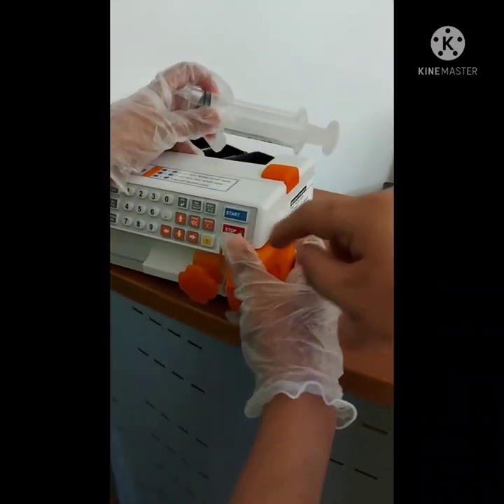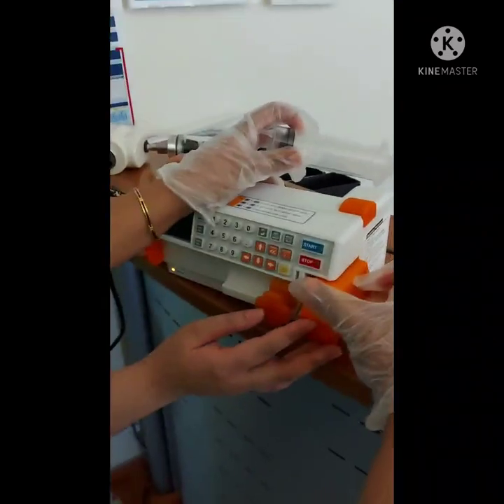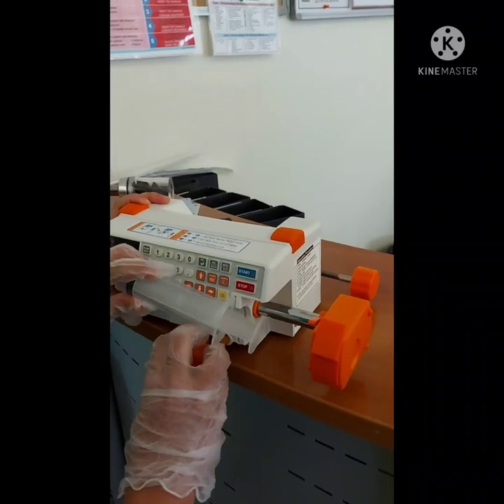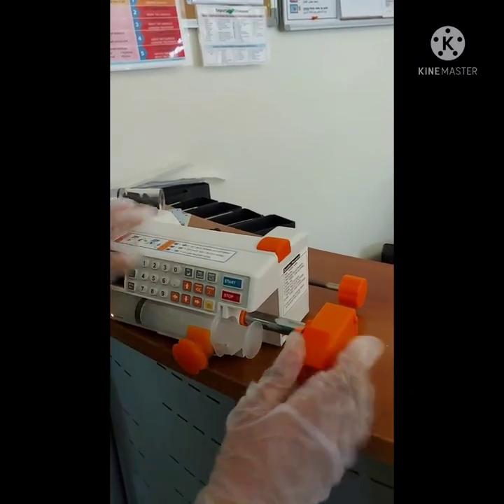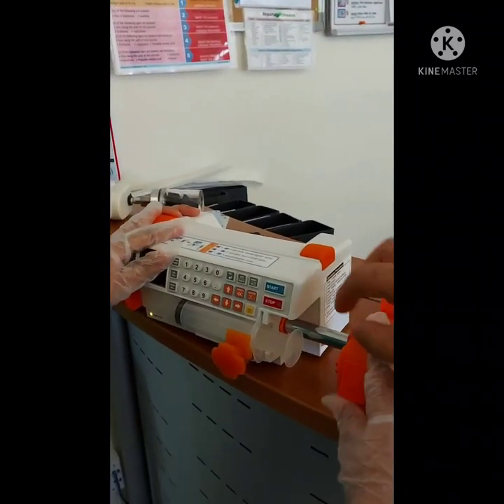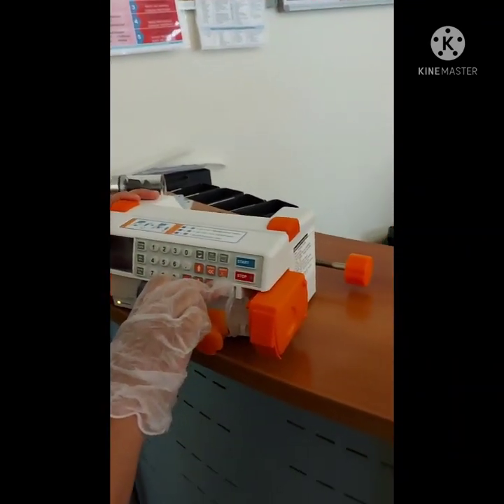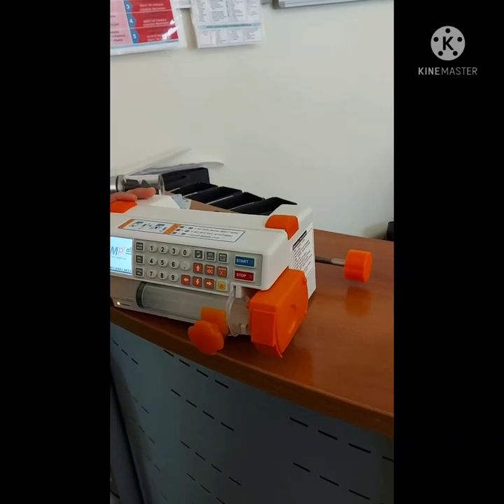Open the lock. Then pull. It's easy, it's very soft. And twist it. Look. Open.